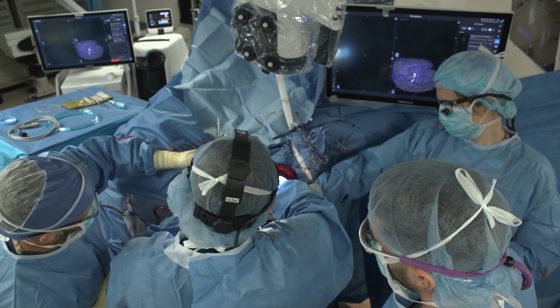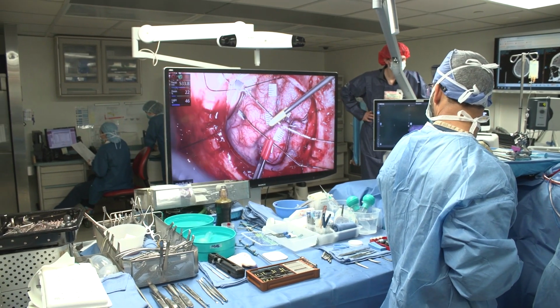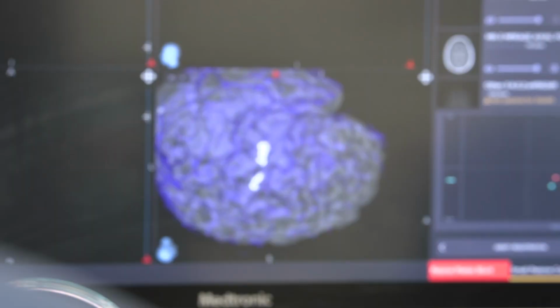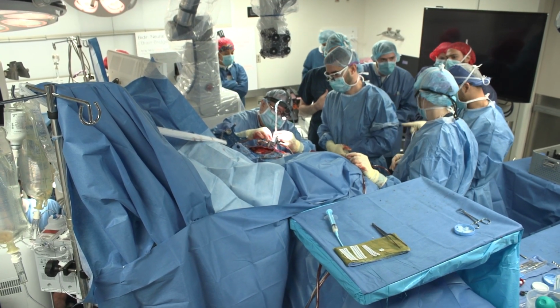At that point, we brought in the actual device, mounted it onto the skull, and then used these wires to gently lay them without damaging them, and place them precisely in those three areas that felt the fingers, as well as the two areas where we knew that his hand motor function was.